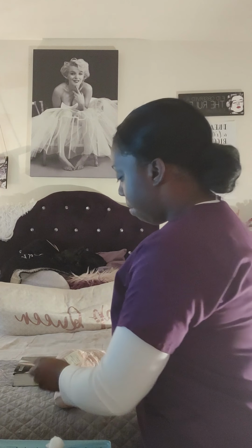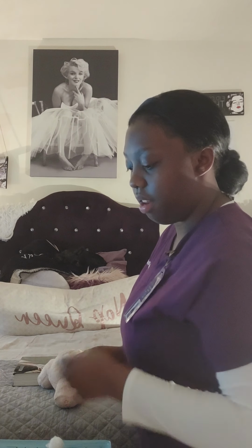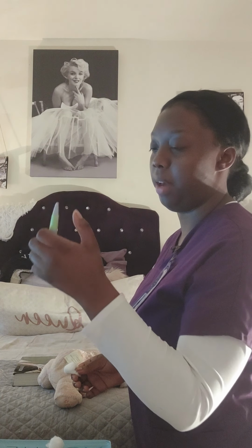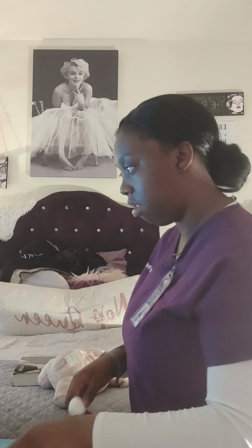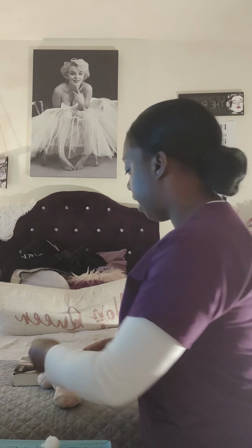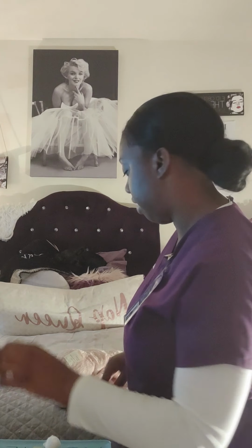Use your cotton swab at the area. And another thing, I know this is a pen, but normally when you pull the needle out, you have something on it that basically brings the needle back in or caps the needle to prevent any needle stick injuries. Alright, and then once you've removed the gauze, you can go ahead and put the Band-Aid on her. And she is good.